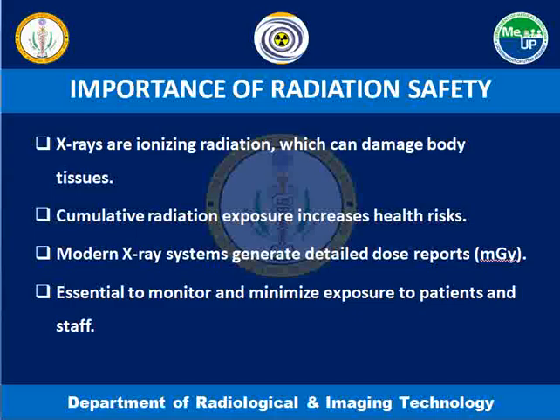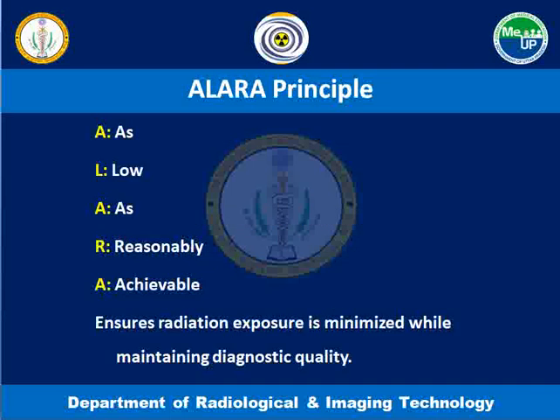To mitigate these risks, modern X-ray systems are equipped with advanced technology that records detailed radiation dose reports in milligray, mGy. Continuous monitoring of these exposure levels is crucial to ensure the safety of both patients and medical staff. Adhering to radiation protection guidelines helps minimize unnecessary exposure while maintaining diagnostic accuracy.